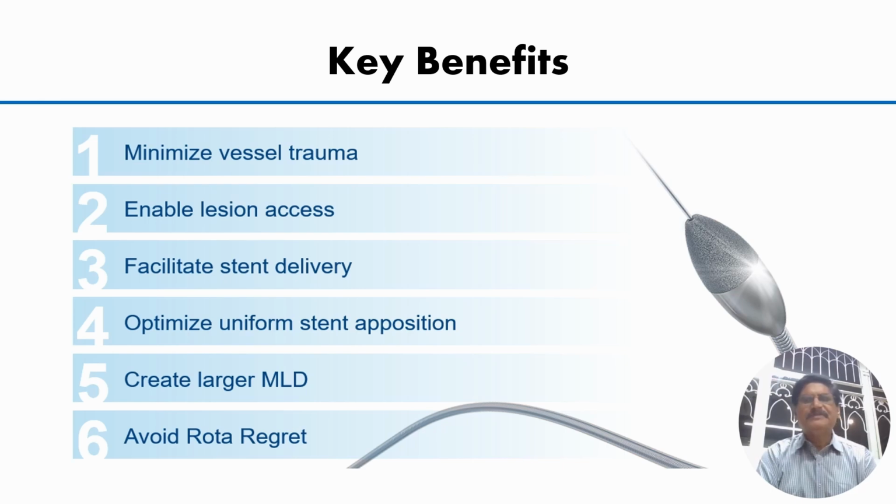The key benefits of rotablation, especially with RotaPro, are that it minimizes vessel trauma, enables lesion access, facilitates the stent delivery system, optimizes uniform stent apposition as well as expansion, creates a large minimal luminal diameter, and avoids the rota regret also.